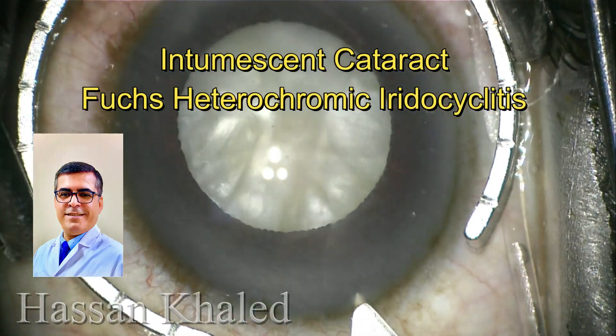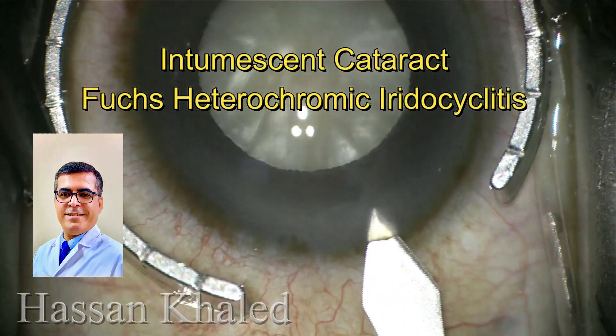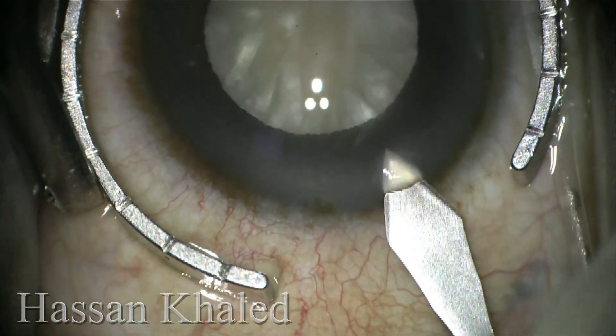Hello, here is the case of intumescent cataract in a patient with Fuchs heterochromic iridocyclitis.